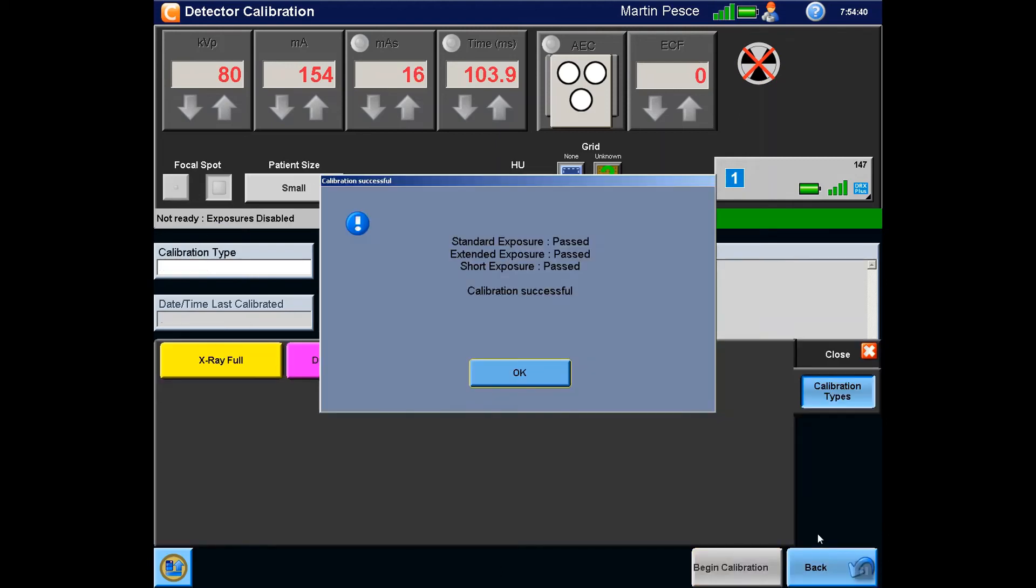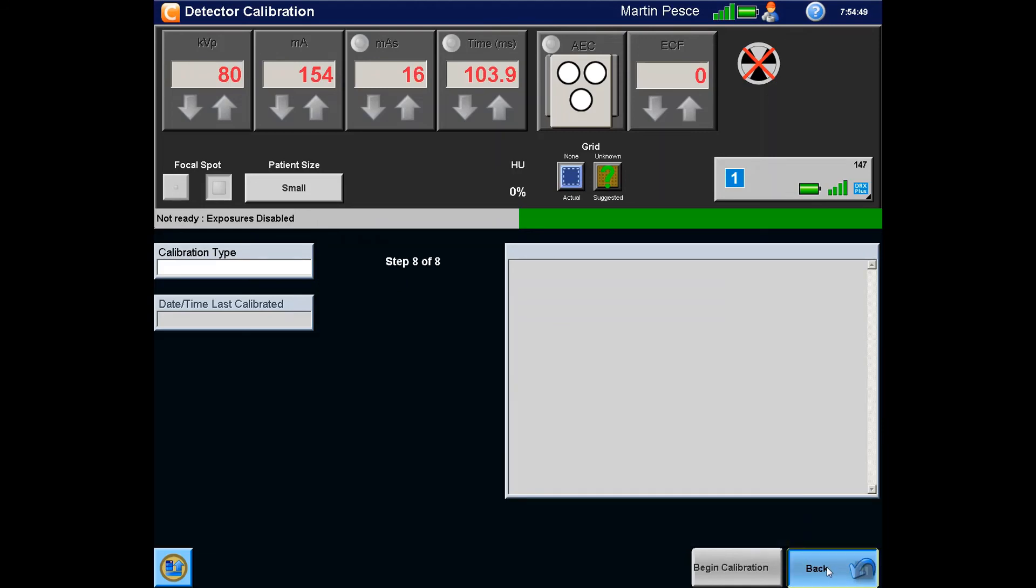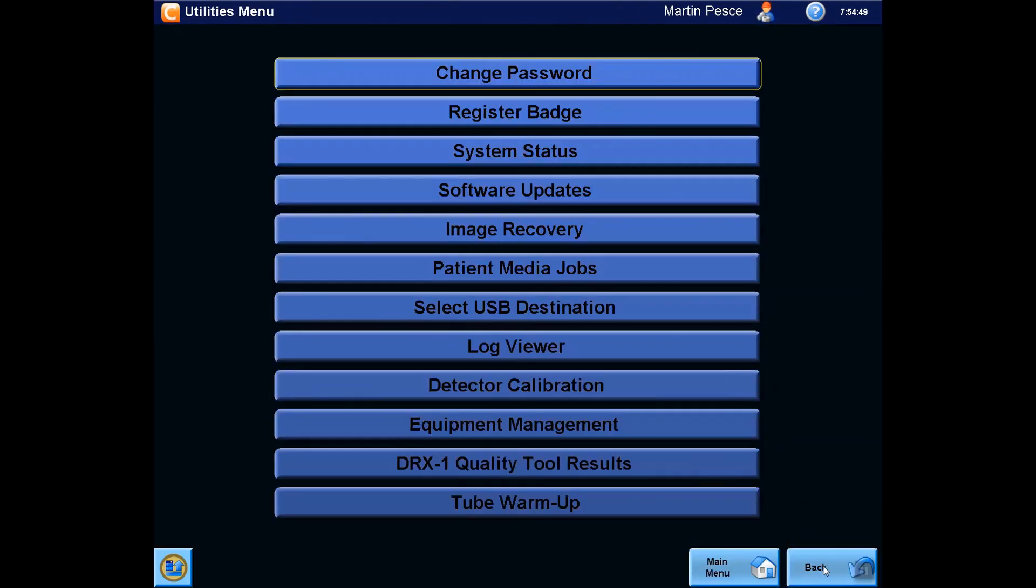When the calibration is completed, a pop-up menu will appear with the pass-fail status of the detector. Select OK to close this window, then select the Back button. Then select the Main Menu button.